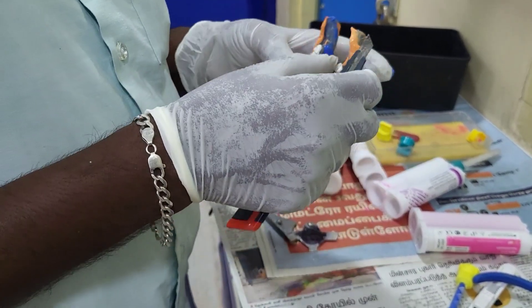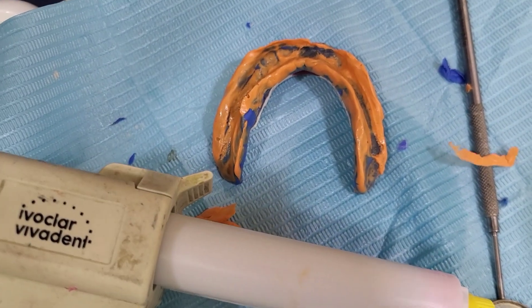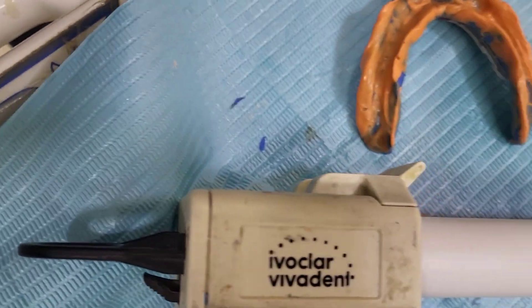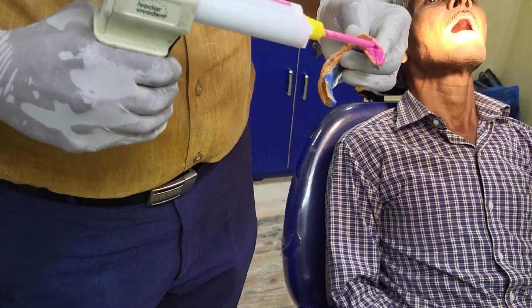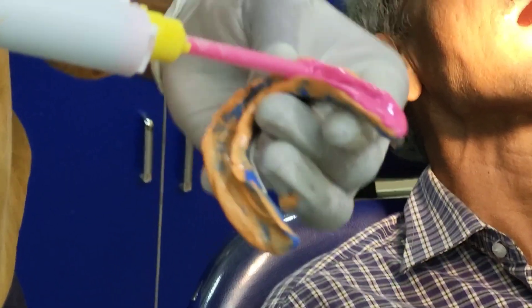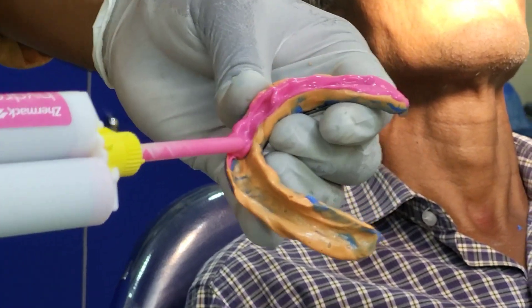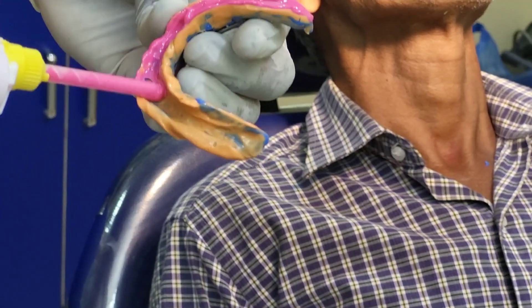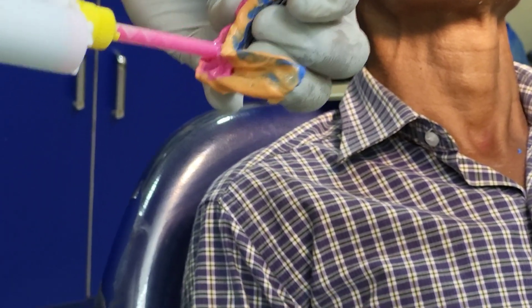We have to remove the excess light body. You can see the secondary impression made with light body. Sometimes during conventional procedure there will be some tray exposure. In BPS technique they use extra fine light body for the secondary impression, but during conventional procedure we can retake the light body impression where the tray has been exposed.